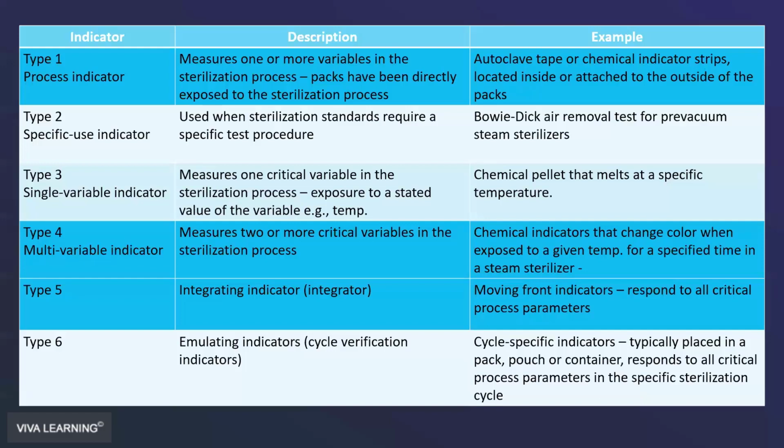This is not to replace a spore test, but it's something, as I mentioned earlier, that is kind of the fill in the gap between the spore tests. And we'll talk about what you do if you get failures either on a type 4 or a type 5 indicator.